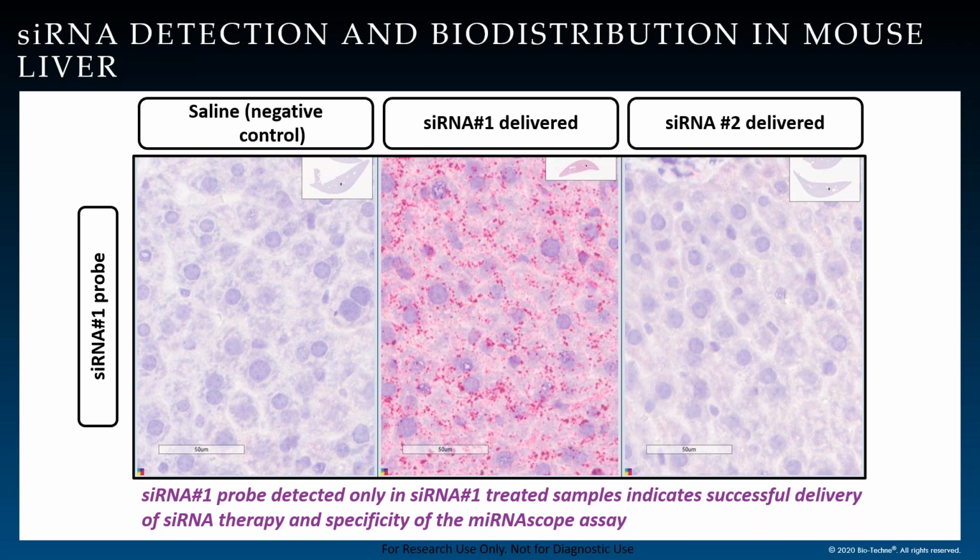So this type of actionable data can now be used to address other key things related to siRNA. For example, is there any particular modification that would be beneficial? You can examine biodistribution of the siRNA as a function of different modifications.